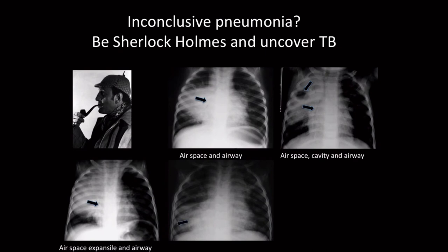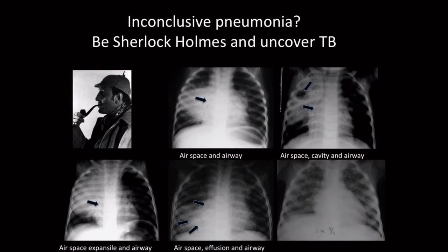One more thing: a patient with a lot wrong with him — there's an effusion tracking up the side, a lamellar effusion; there's airspace disease; you can't see the right cardiac margin. And look through the density — there's your compression.